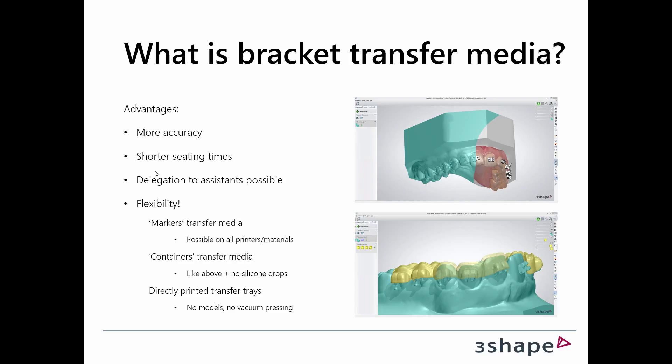That's very time-consuming and not accurate enough. When we talk about indirect bonding, we need a way to transfer the bracket positions that are set digitally in the software so it actually ends up in the right position in the patient's mouth. It also means that you'll be able to maybe delegate this to some of your assistants.